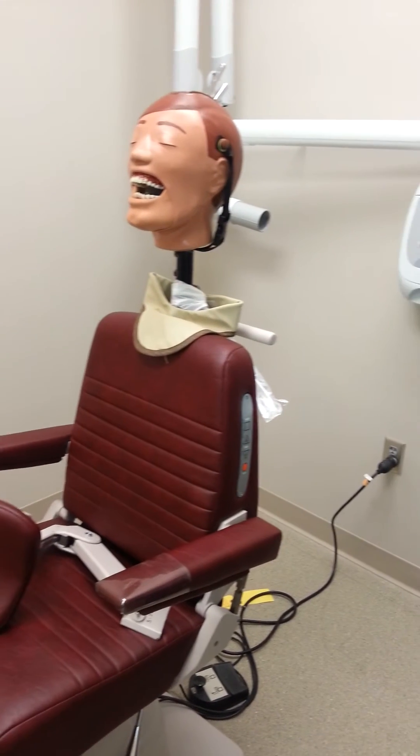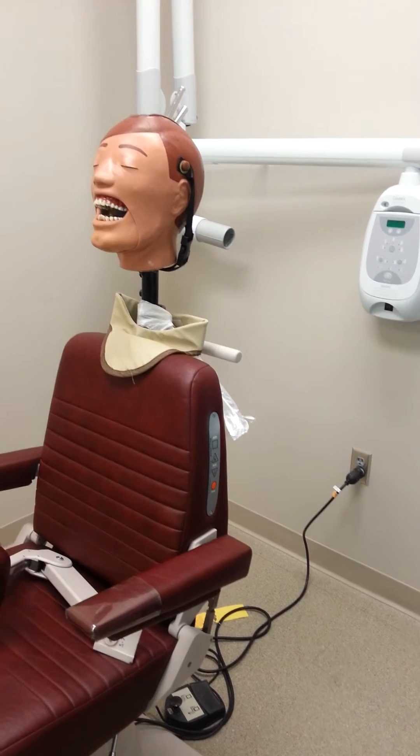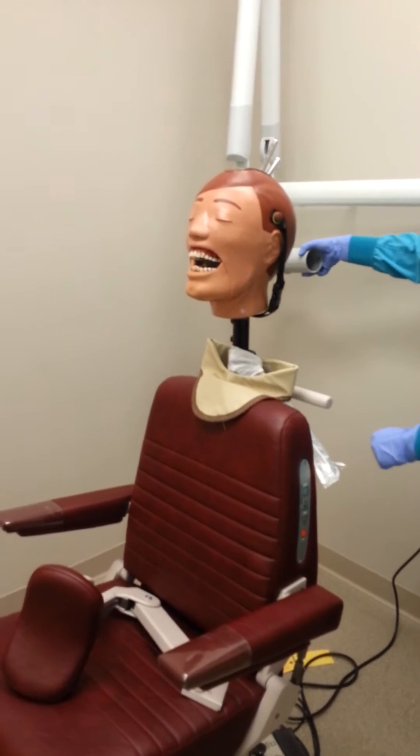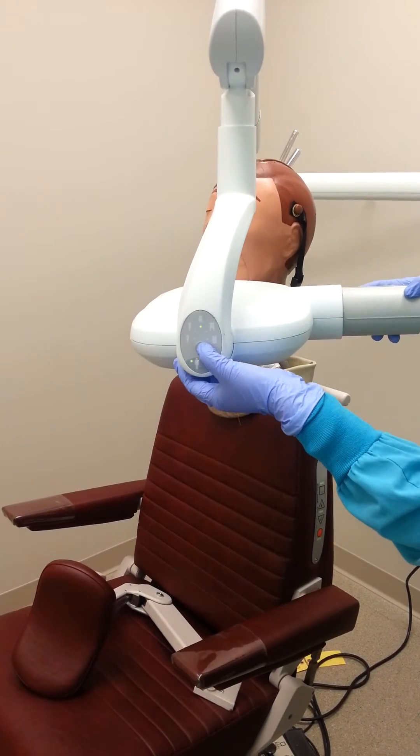Next we need to turn on our machine and double check that it is on the correct setting for the mandibular anterior occlusal radiograph. For this radiograph we will need to place it on the anterior setting.